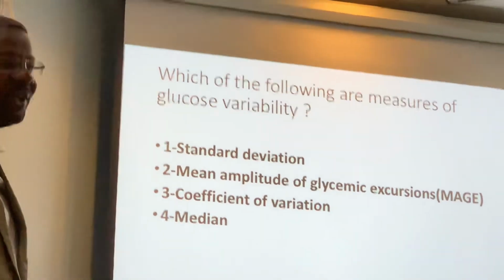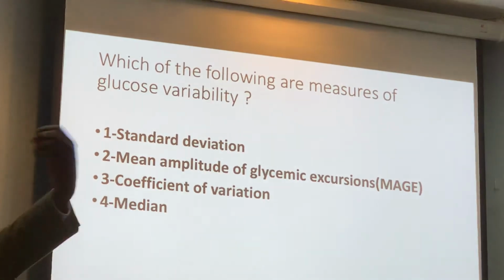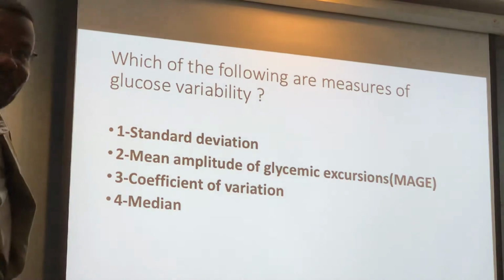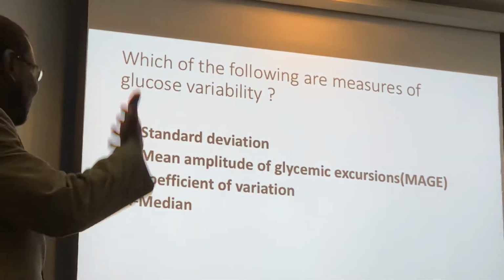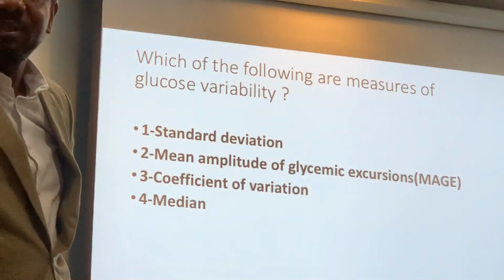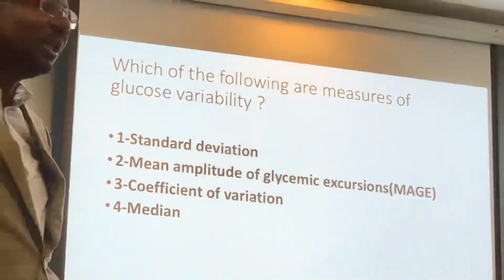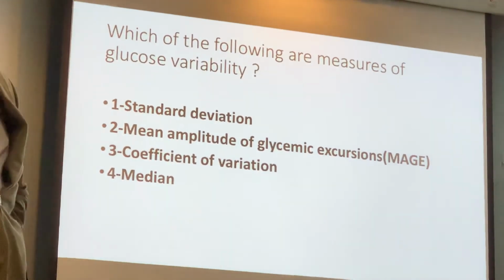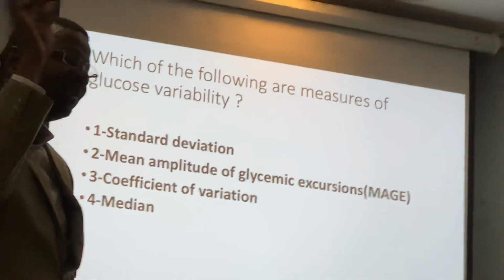The median? No. So basically, it may not be like a question in the exam, but if you start to talk about variability in the previous tracing, and they ask you how you measure the variability, I think you need to be prepared to say, okay, well, there are measures: the standard deviation, the coefficient of variation, and that actually can impress. That can give you the full mark. Because even if you made a mistake somewhere else, when you know these kinds of things, they will show that really you know more than average, and that can really help. So this is why you practice this with time, because the station is only around 7 minutes.